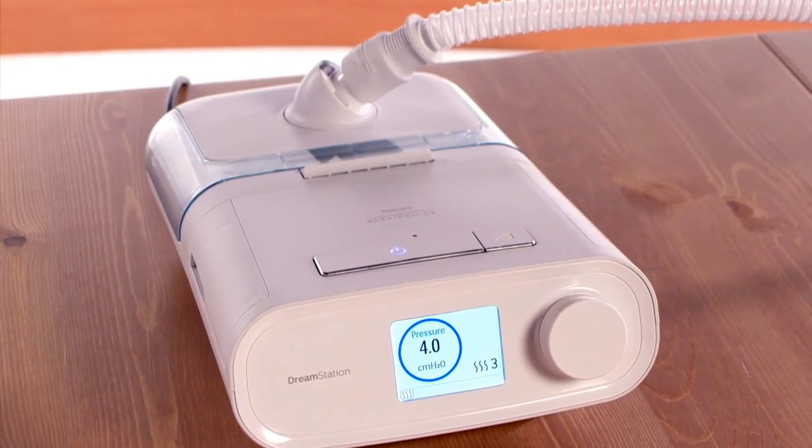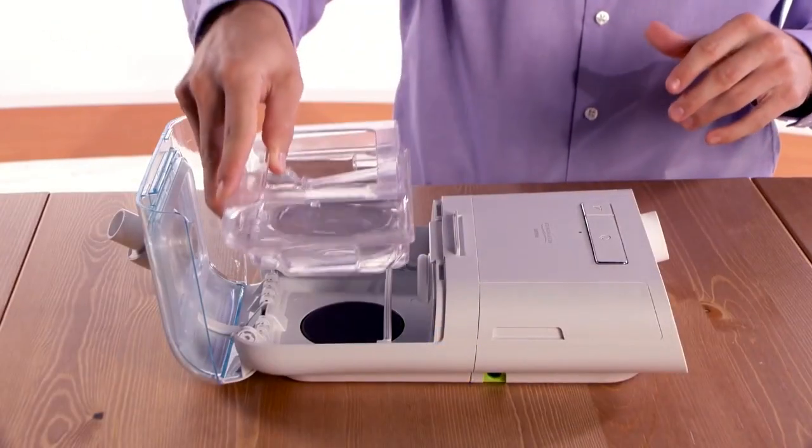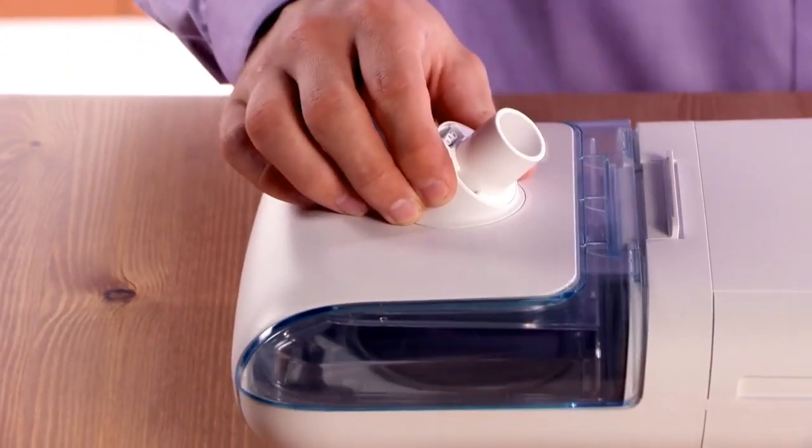Adding the optional humidifier to DreamStation can make therapy more comfortable. Fill the humidifier water tank with clean water before bed. Always remove the tank before filling.